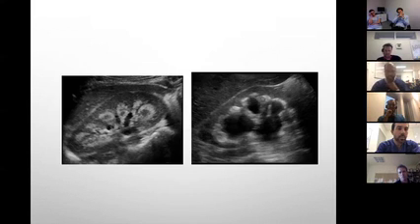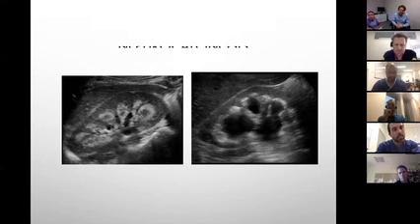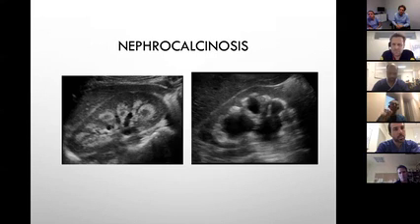When you start scanning kidneys, quite often you will see this kind of calcified-looking pyramids. They're just a case of nephrocalcinosis. It could be as mild as just echogenic pyramids, or it could even look like denser structures, depending upon how dense the calcifications are. I just want to throw in, along with the stones: these people are prone to have multiple stones, so they're going to have stone disease and renal colics quite often.